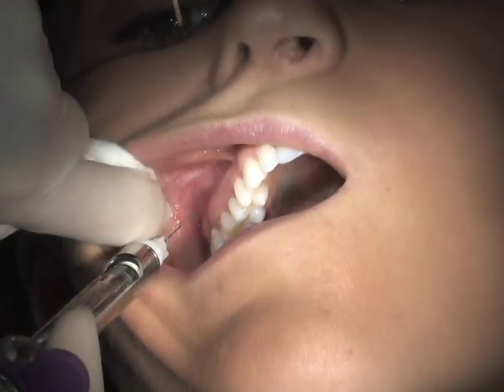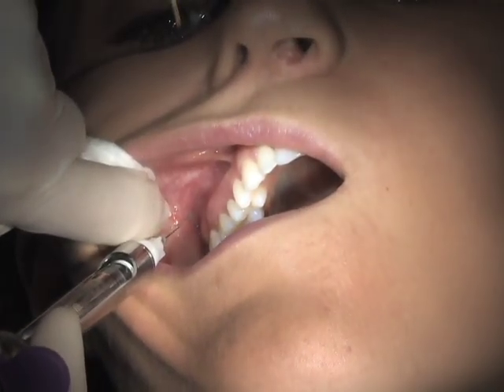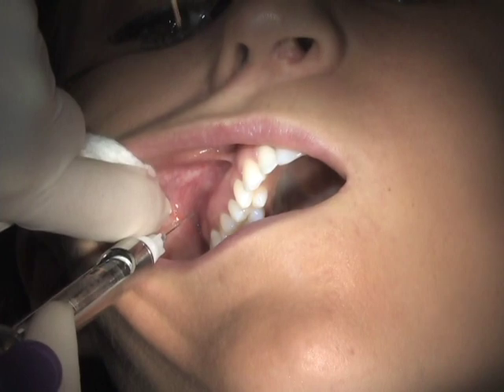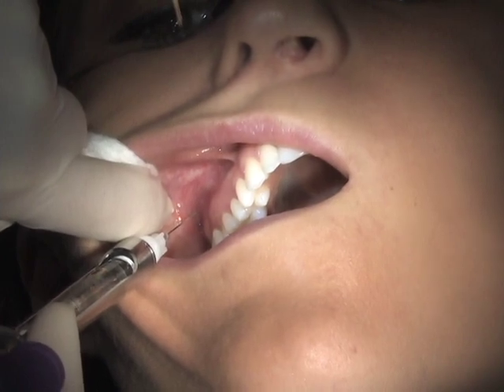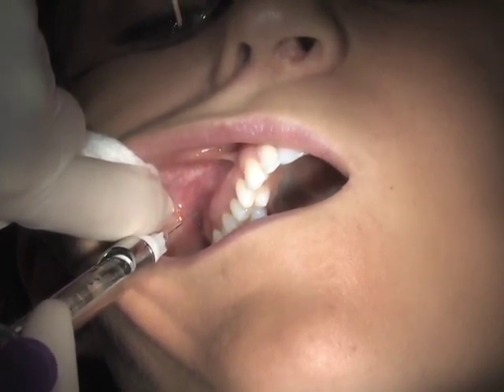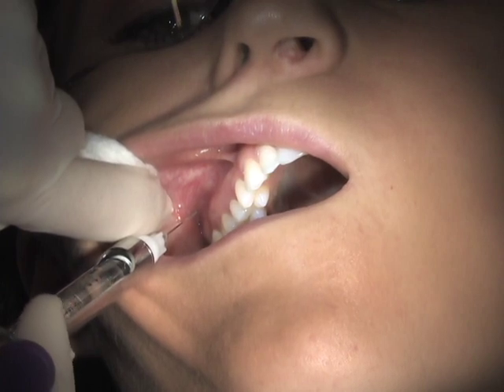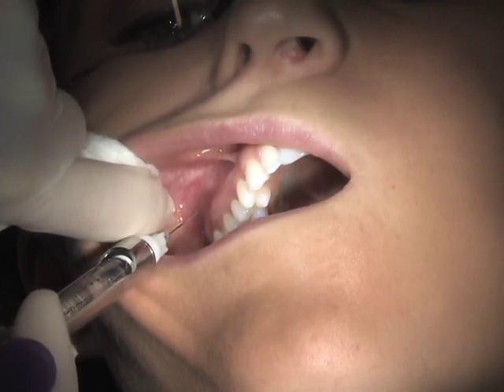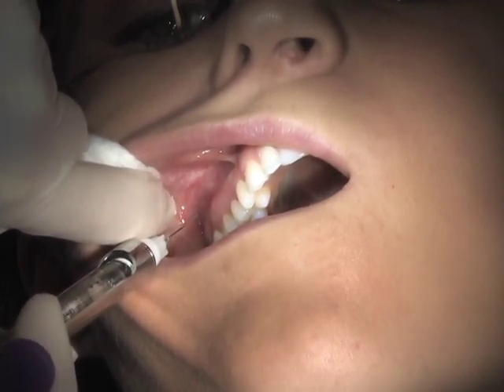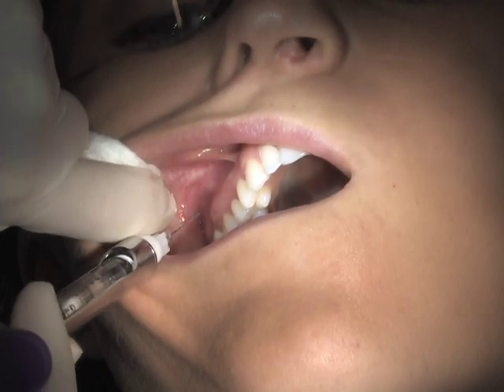To achieve this, the barrel of the syringe must be angled downward from the occlusal table and outward from the patient's midsagittal plane. You can see that this places the barrel of the syringe over in the corner of the mouth and at about the same angle as the corner of the patient's nose.